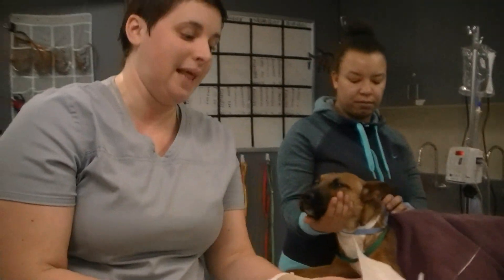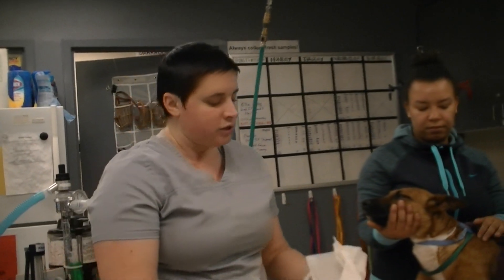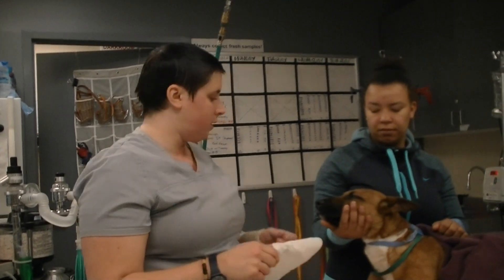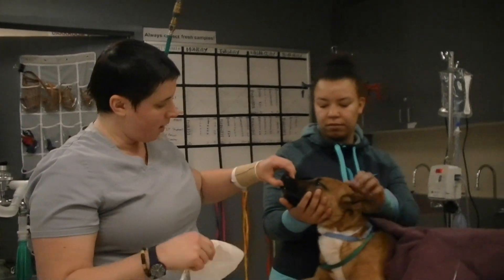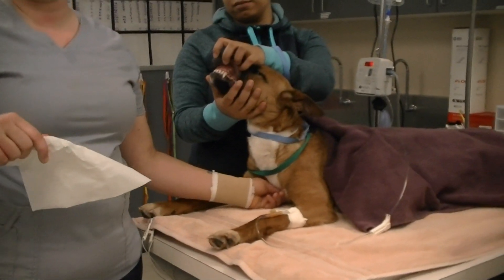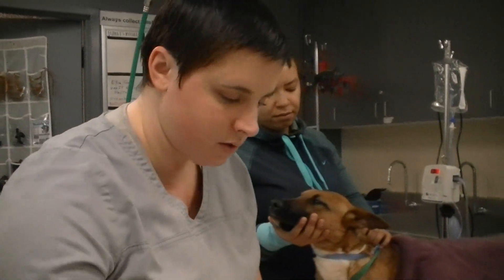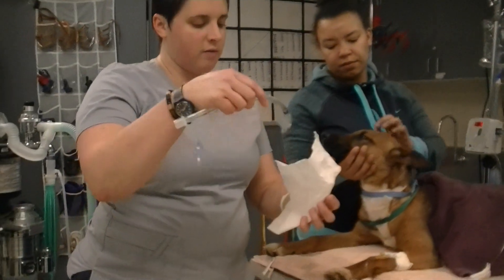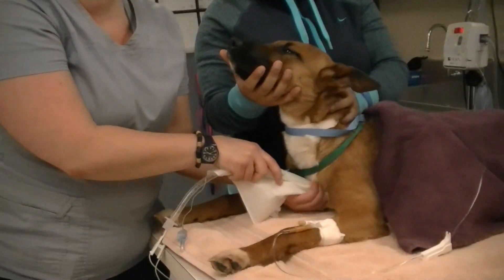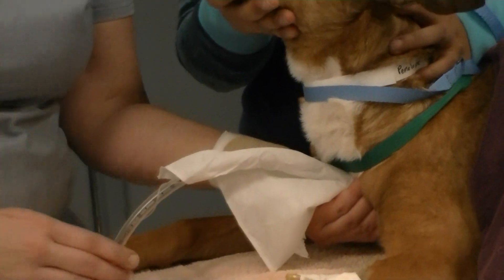The next thing I need to measure for is length. I want to make sure that I don't put this tube in too far. My points of reference are going to be the incisors to the cranial process of the sternum, which is known as the manubrium — I can feel it right here. I'm going to use my longest tube, cover the end so it doesn't get contaminated, and hold the tip right to the top of the manubrium.